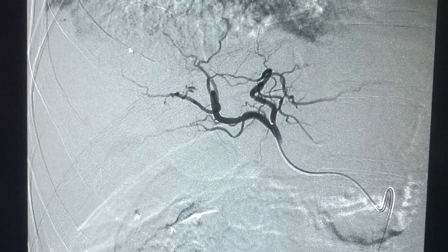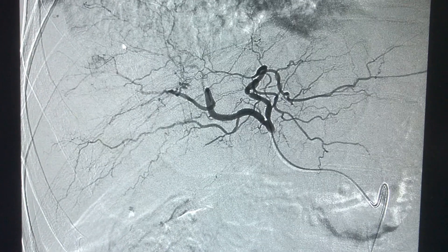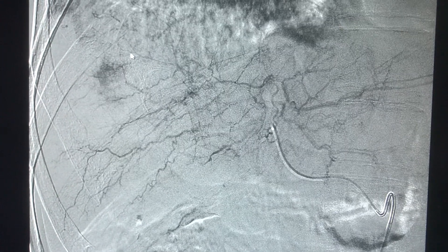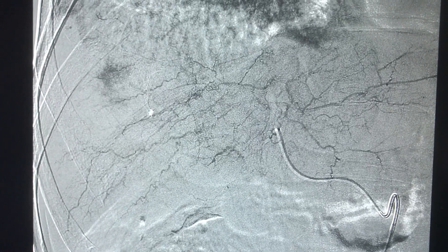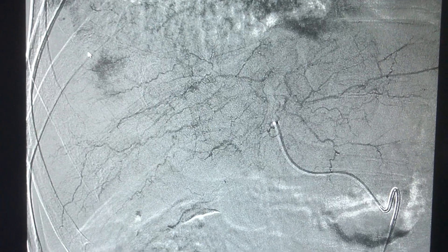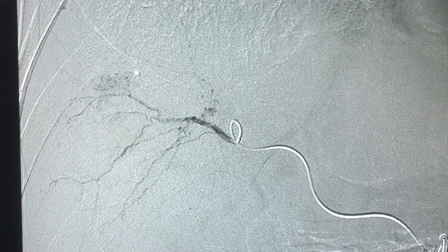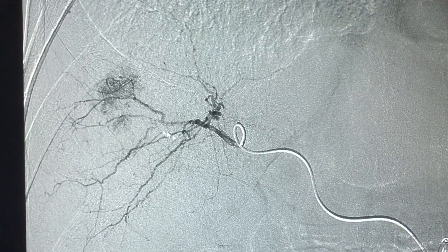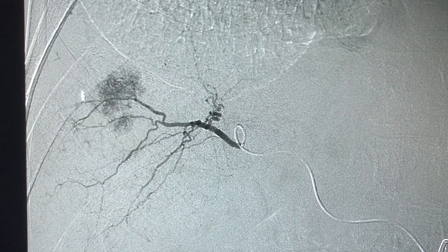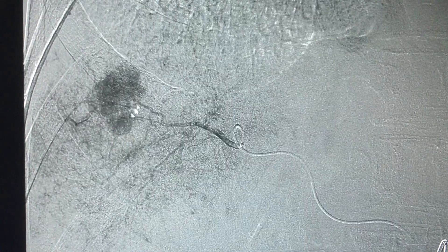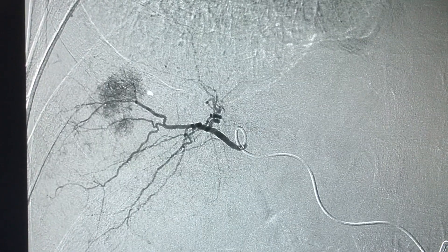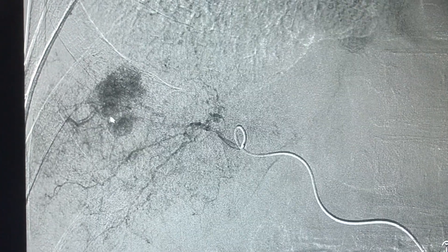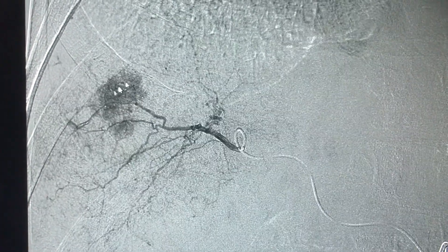The next stage is using microcatheter technique to get deep within the hepatic artery to find that tumor and find specifically the artery that's feeding the tumor, in this case right here. We have found that artery feeding the tumor, which is a branch of the right hepatic artery, with the tumor showing hypervascularity here — meaning that there are a lot of vessels feeding this tumor.